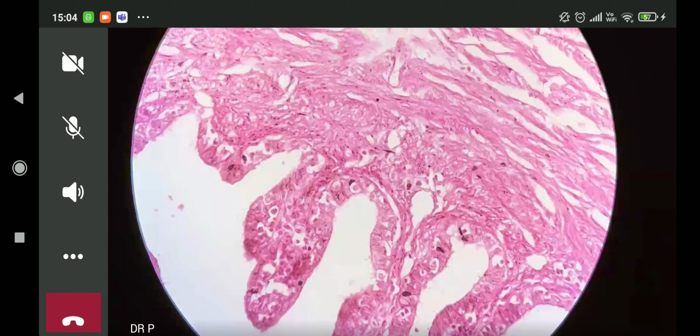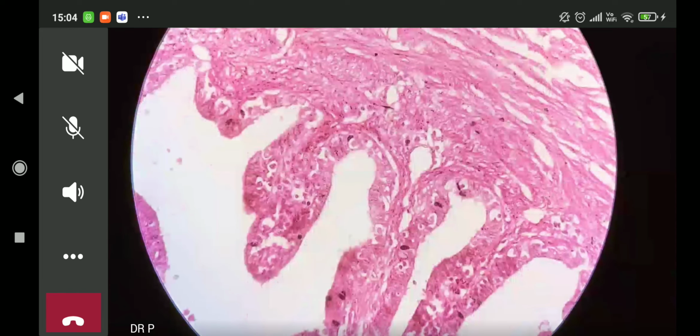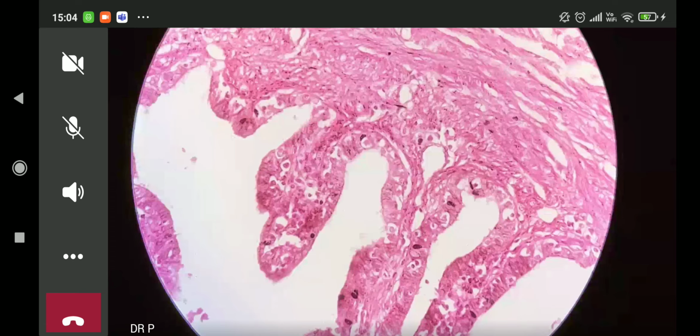So then you have the tubal lining epithelium, you have the secretory cells, okay? So secretory cells have an increased NC ratio, and you have something called as the intercalated cell, right? So this is nothing but the fallopian tube. This is the mucosal aspect, fallopian tube mucosa, and then we go on the outer aspect and you have the serosa, which is composed of adipose tissue, and you have all these holes in between.